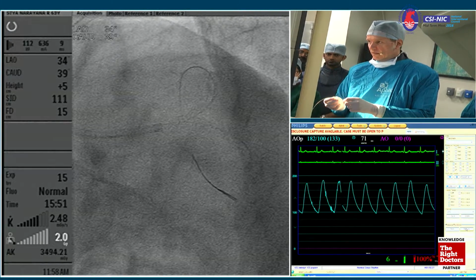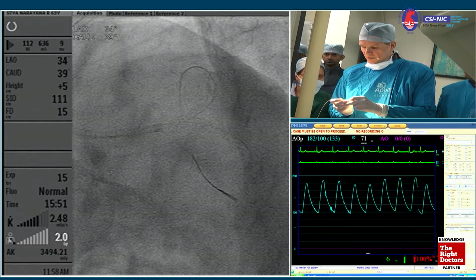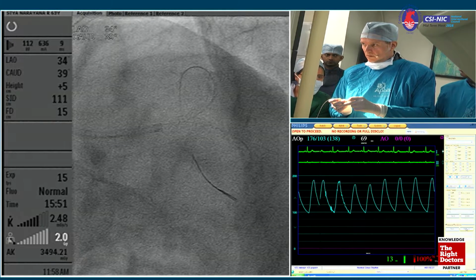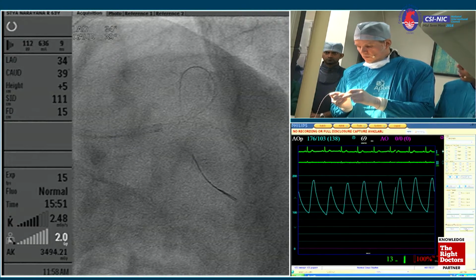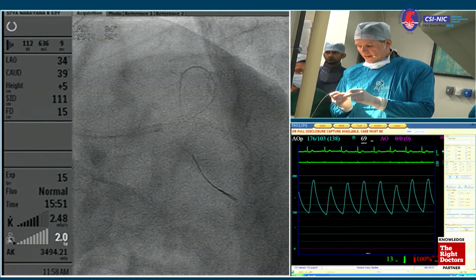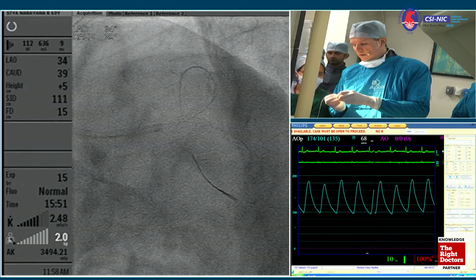And maybe we take a 3.5, 10 or something stent. Yeah, 12, 10. If you could show us quickly in 1 minute time, you will be disconnected. 3.5, 12 we have. Yeah. If I can make it. What size of stents is taking? What size you are taking now?